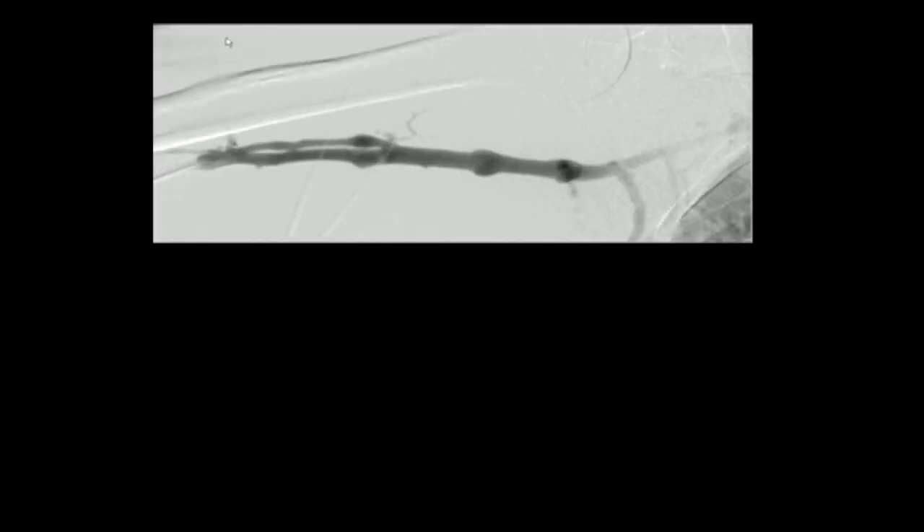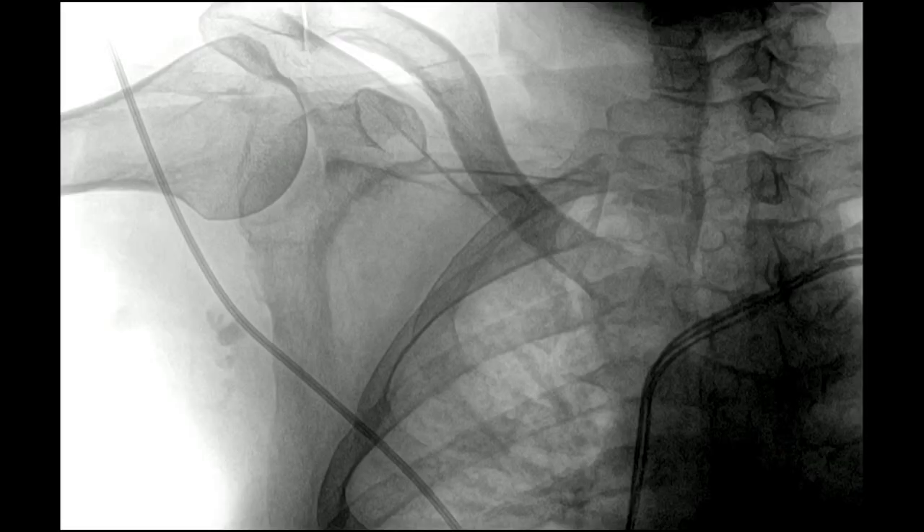Ultrasound is always set up on the opposite side of the table. You can see we've brought access into the sheath. The upper arm veins are adequate and patent, but what we're really interested in is the central vein circulation. Here you can see the defibrillator wires coming in from the opposite side.